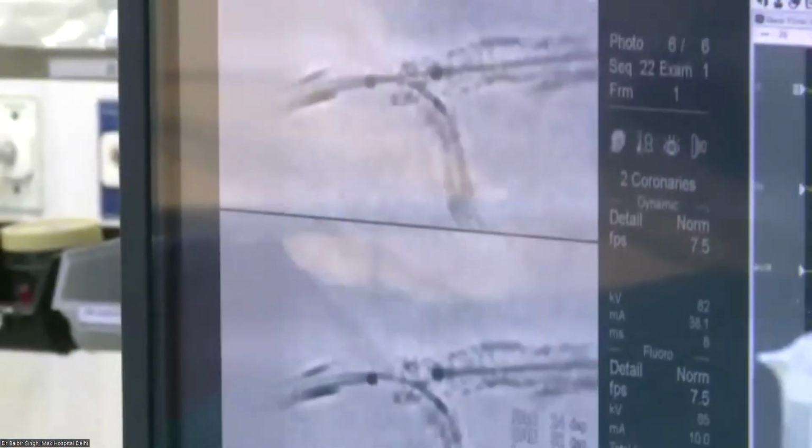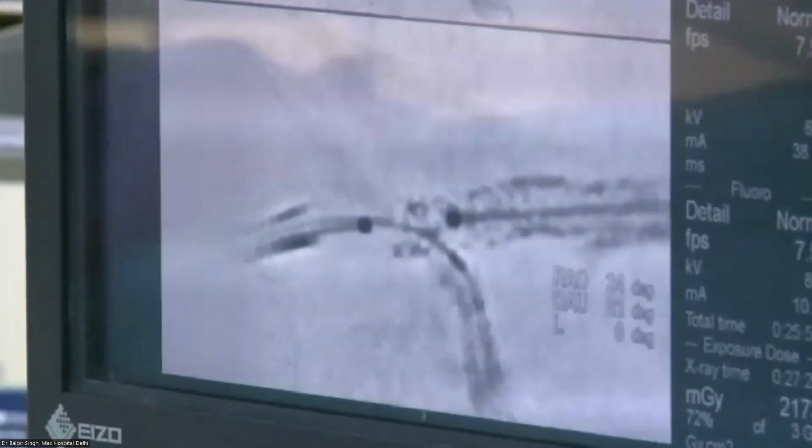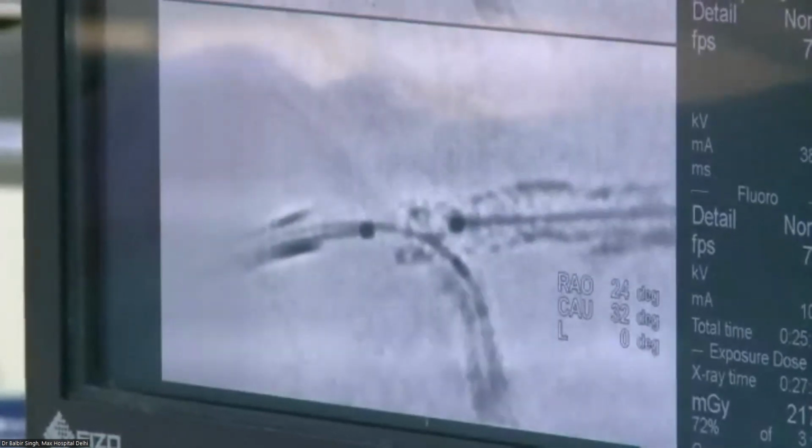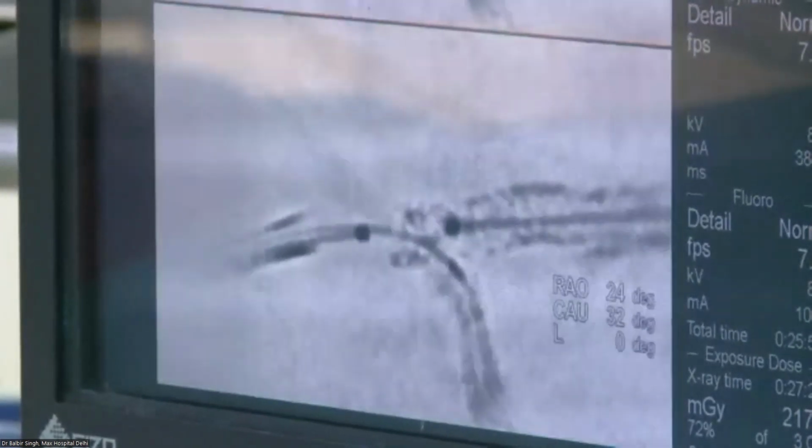Can you see the deformed stent? Even though the stent is a Xience, which has the best radial strength, when we do such aggressive trying to get in, we get into these problems. So we corrected this with a POT balloon. Next angio. Go back now to the angio.